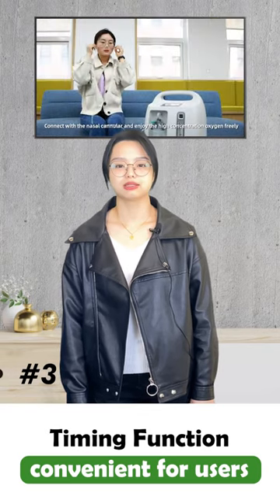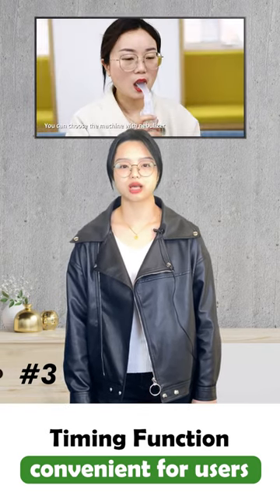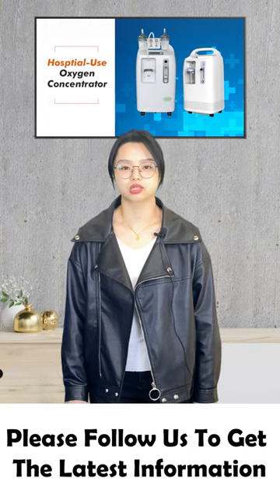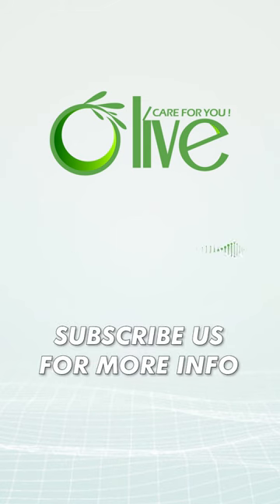Third, there is a timing button on the screen of this machine. This function is very convenient for users who are trying to sleep. If you are interested in the machine, please follow us to get the latest information. Olive — care for you.